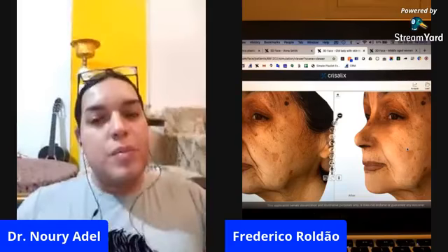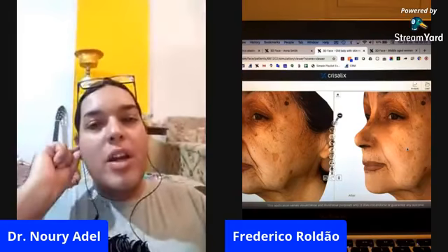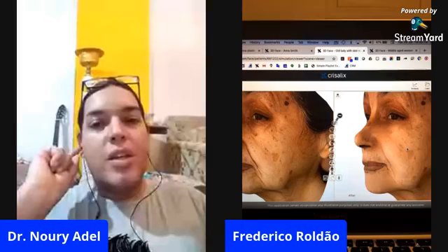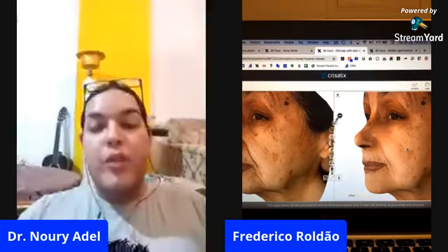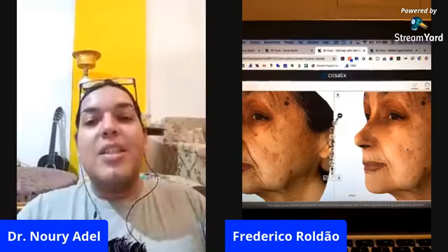Exactly. Do you have live questions from your viewers on the webinar? No, you just finished your demo, right? If you're happy with it, unless you want me to show something else. It's amazing. If you want to go on with anything else, go on. No, not really. I think I'm done here.